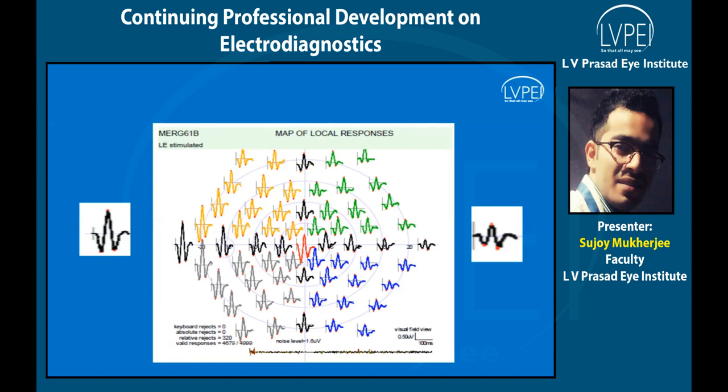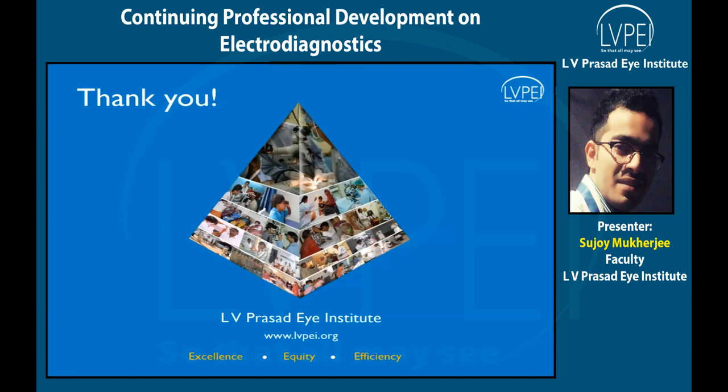and that leads the waveform to appear like this. Keeping in mind that the noise level and the eyeball movement trace graphs are also within the normal range, that is acceptable. This is particularly known as the sloping effect. That is a kind of artifact. With this, I'm ending this session of my case. If there are any questions, I'm glad to answer.